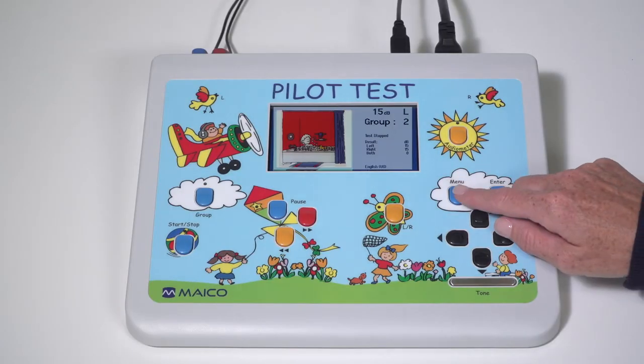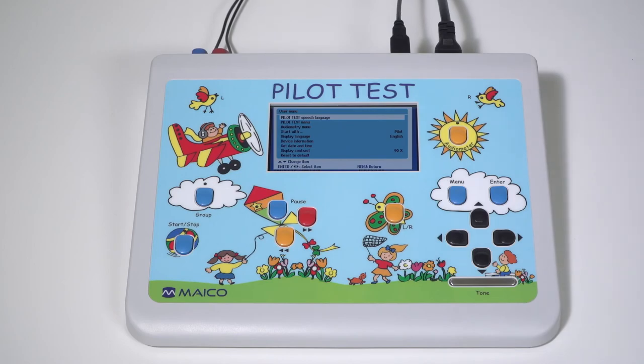To access the settings menu, press menu. Menu options are available individually for pure tone audiometry and select picture audiometry.